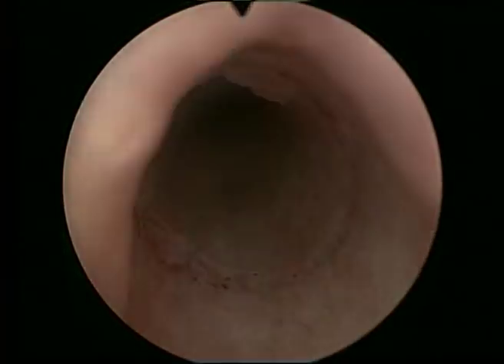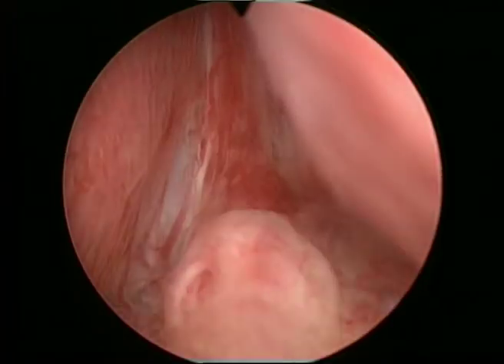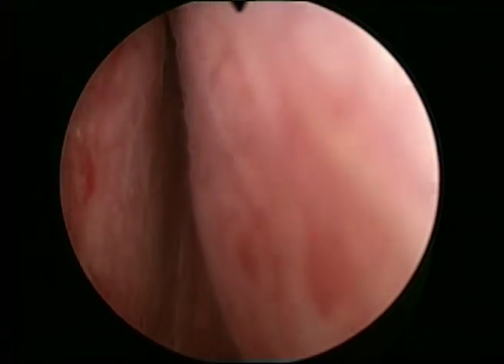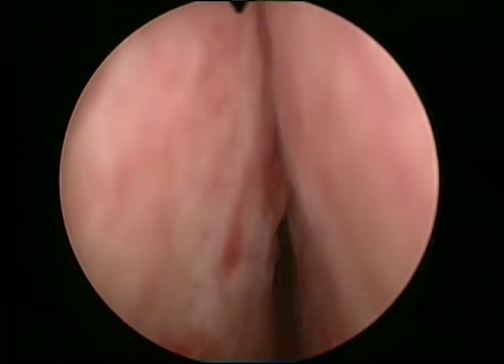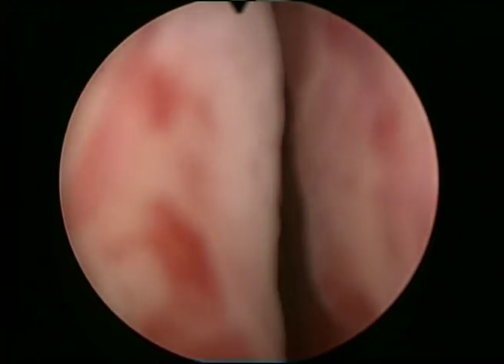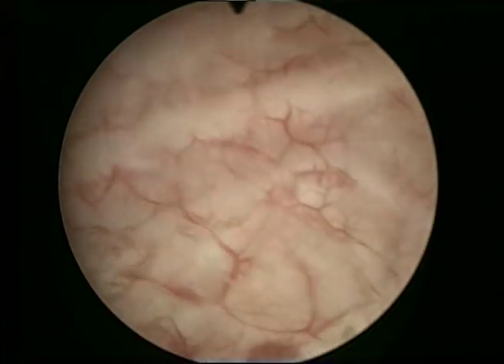This is the urethra. We are introducing the cystoscope and approaching the sphincter. I always like to keep a very good eye at the sphincter and to understand the anatomical relationships of the sphincter and the verumontanum in each individual patient, because it's very important to plan the operation and to allow for a successful recovery without risk of incontinence.